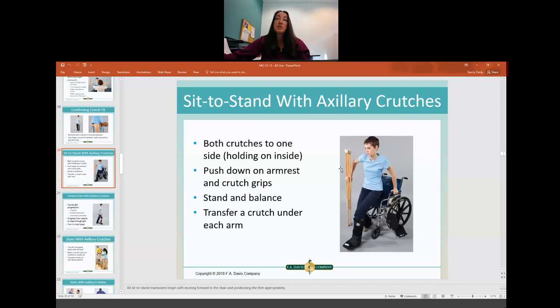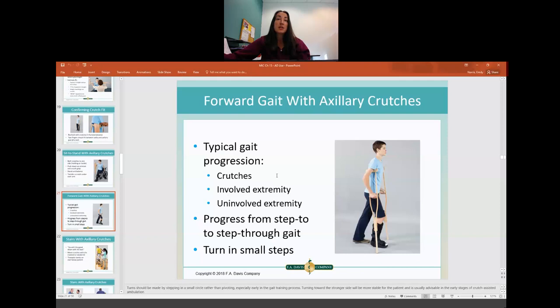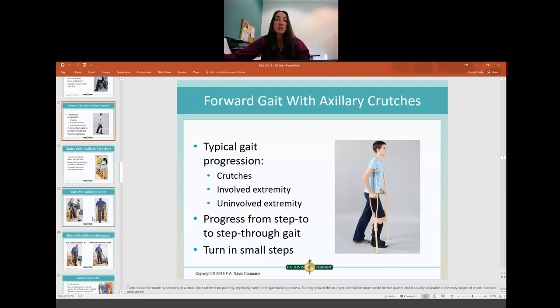To do a sit-to-stand transfer with crutches, move both crutches to one side, use one armrest of the chair and the hand grips of the crutches to push yourself up. Once you're up and stable, put one crutch under each arm. With crutches, you typically do crutches first, then the involved leg, then the uninvolved leg — or sometimes the crutches and involved leg at the same time since it basically swings through. When turning, make sure the patient does small, incremental steps rather than one big turn.